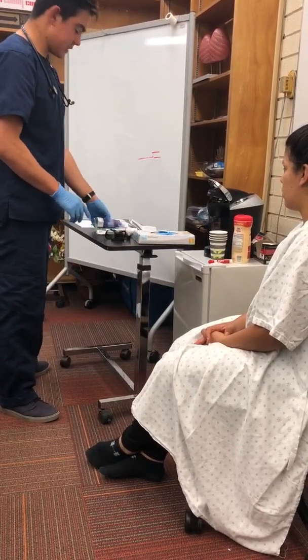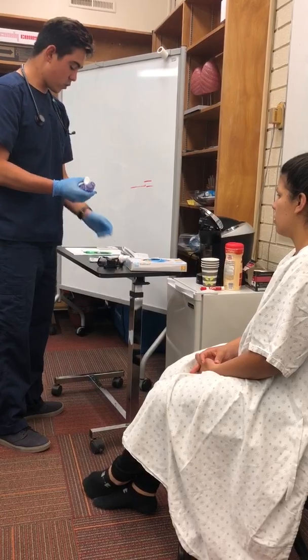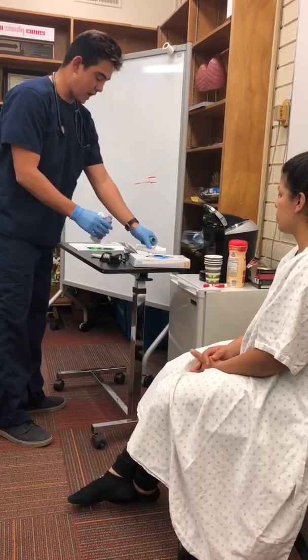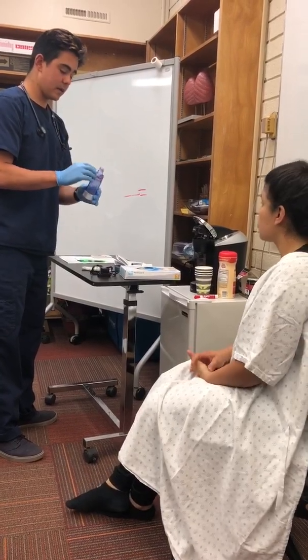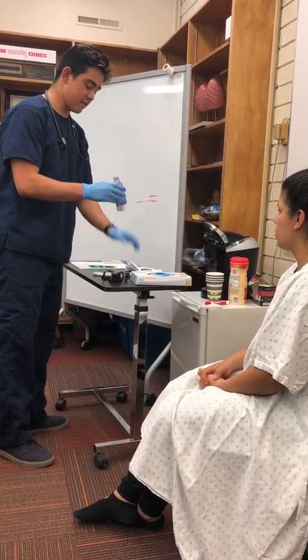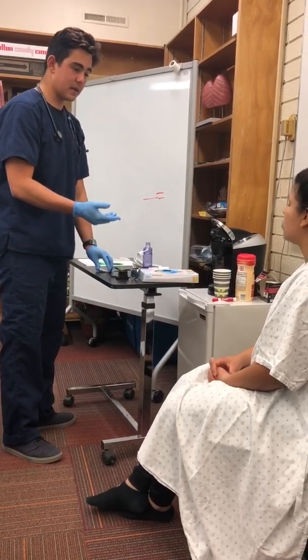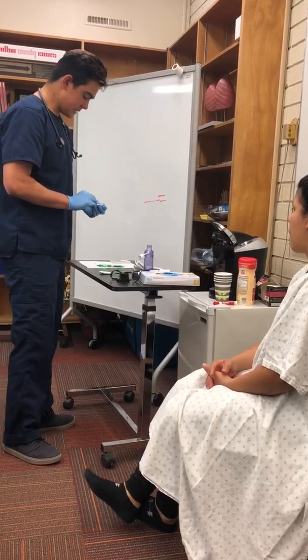So now that we're done with this, we're going to go ahead and clean our equipment, okay? For this, we're going to want to rinse with warm soapy water. We're going to take the albuterol out, and we can rinse all our equipment with warm soapy water. We're going to leave it to air dry. We don't want to clean, especially the spacer, with any paper towel or napkin, to avoid creating static. The static will hold particles inside the chamber and create a film on the inside of the wall. So we're going to leave all that to air dry. Afterwards, we can make a bag with your name on it to keep in your room for future treatments or when you take it home. Okay. I'm going to go ahead and disinfect this.